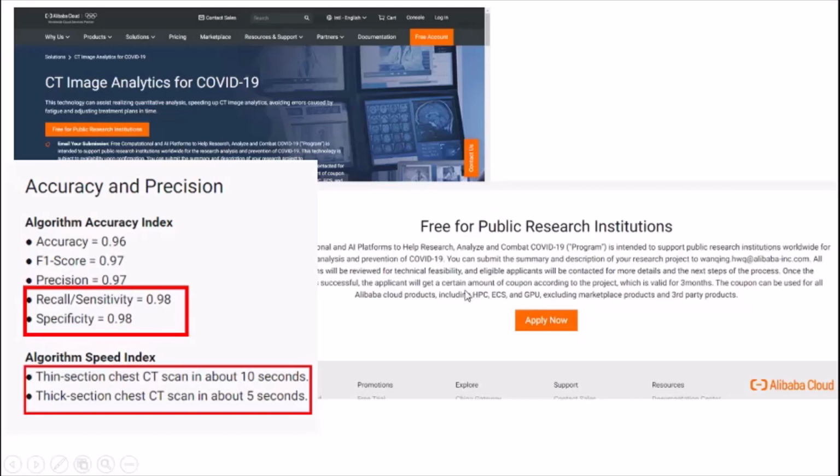But I think if there's any way that we can contact this company, if we get overwhelmed, I think it's a good thing to have. If we don't have enough radiologists, we can just send the DICOM files, or just connect our PACS systems in the hospitals with them. But I don't know, these kinds of technical issues are beyond my expertise. So maybe if you have any IT people in your hospitals, you can discuss this issue with them. I think it's possible to use it also.